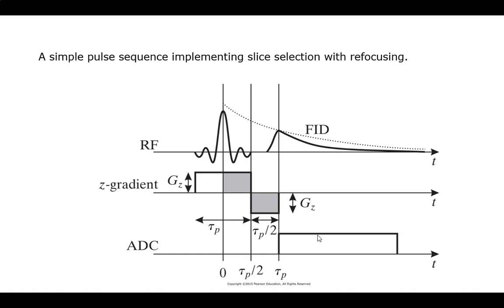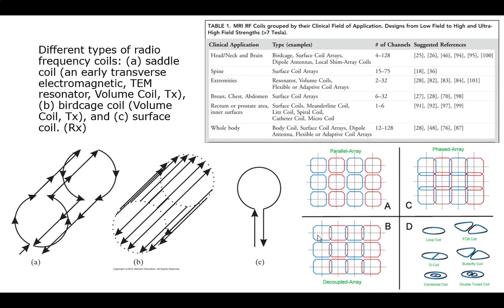This one I think is fairly straightforward. Once the FID hits that peak, that's when you want to start doing the readout, the analog to digital converter, the ADC. This is when you would do the X shifting. We haven't done any phase or anything of that sort on this, but just note that this is the simple thing: kick it and listen to the ring. While you're listening to the ring, that's when you would set the X. The book mentions it in a couple places, but since we've already discussed some of it, all right, if that makes sense.